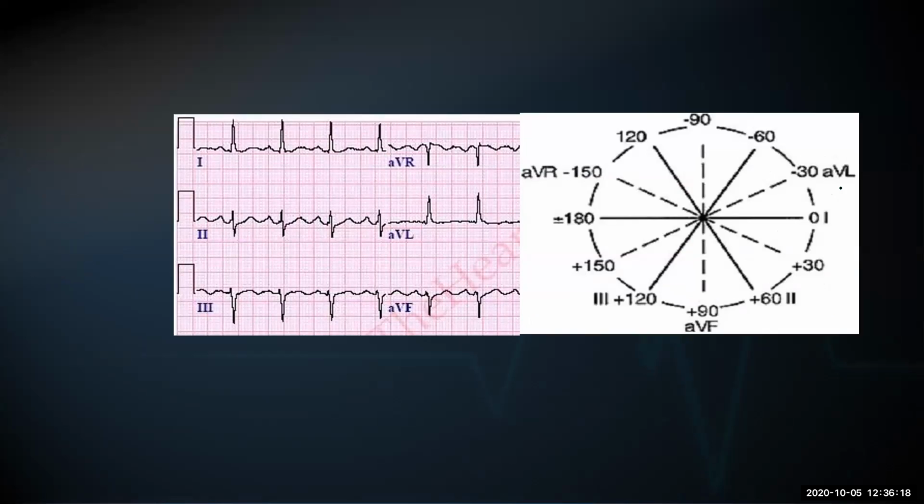So let's look at this one. What do you guys think this looks like? Normal axis, right axis, or left axis? Yeah, it looks like it's left axis, right? Because we have 1 going positive, we have AVF going down, so they're leaving each other. Left axis, L, starts with the letter L, so left, or L also starts with the word for leaving.